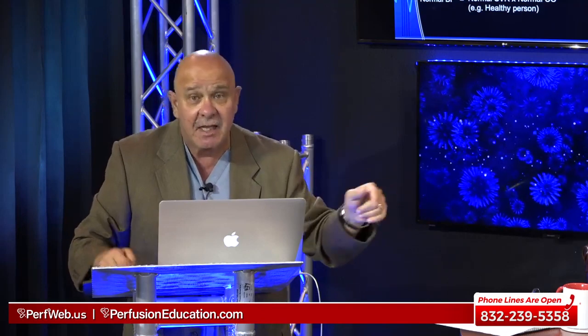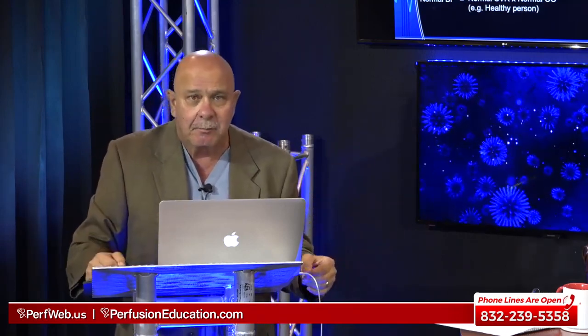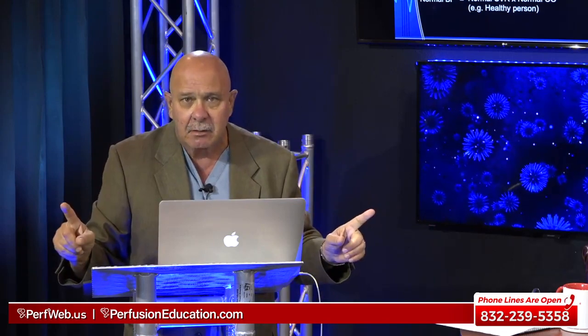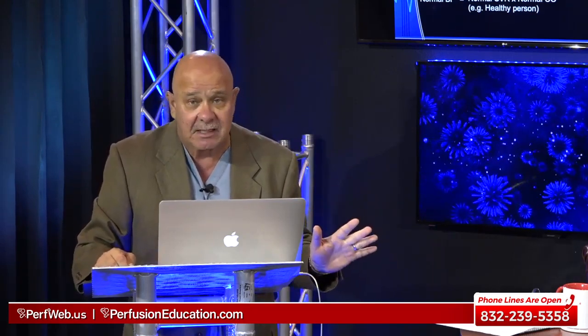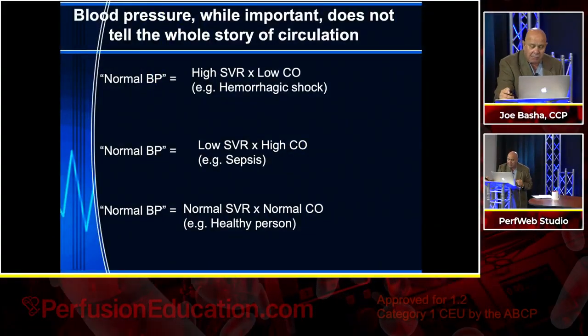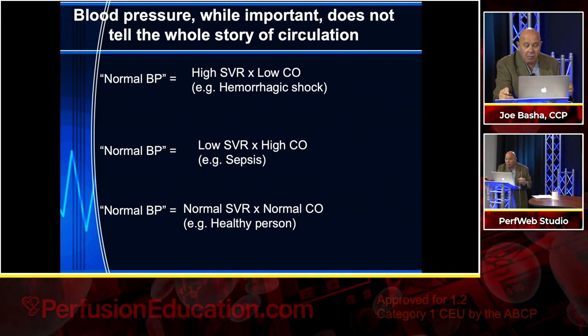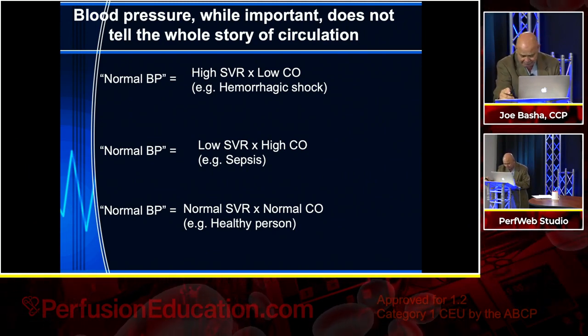You can do VVA if you really want to. You could do VVV, but you cannot do VA with peripheral cannulation. You can do it with central cannulation if you want to, but that's about it. And I don't even suggest that. You can have a normal blood pressure with a normal SVR and a normal cardiac output, as you would find in a healthy person.